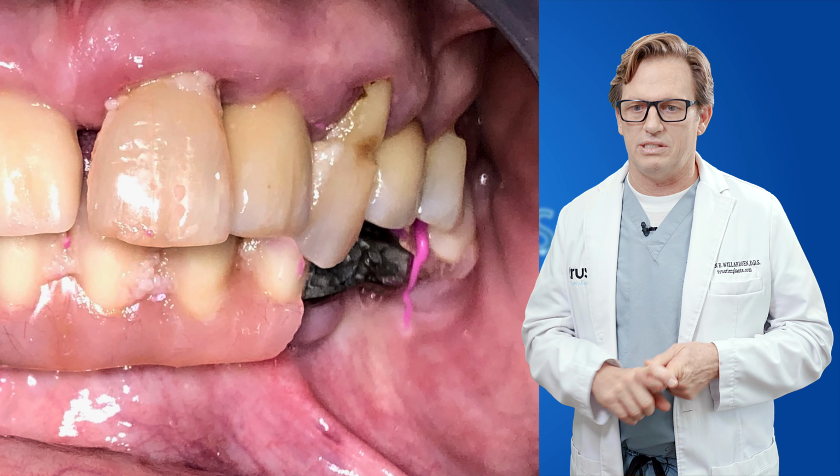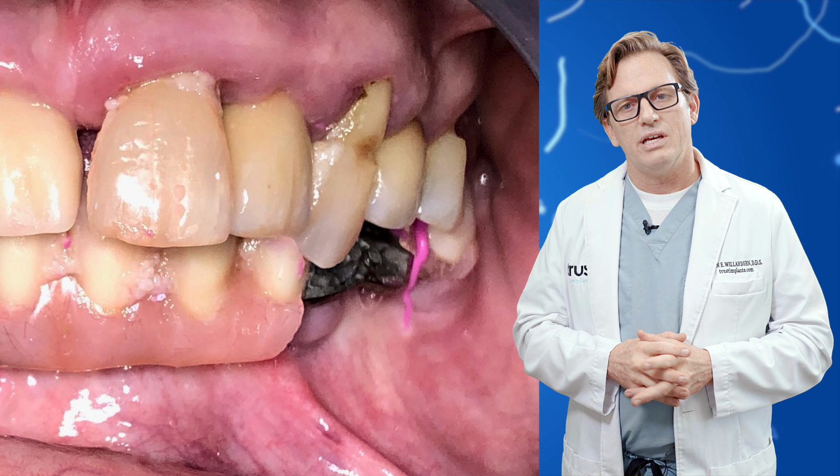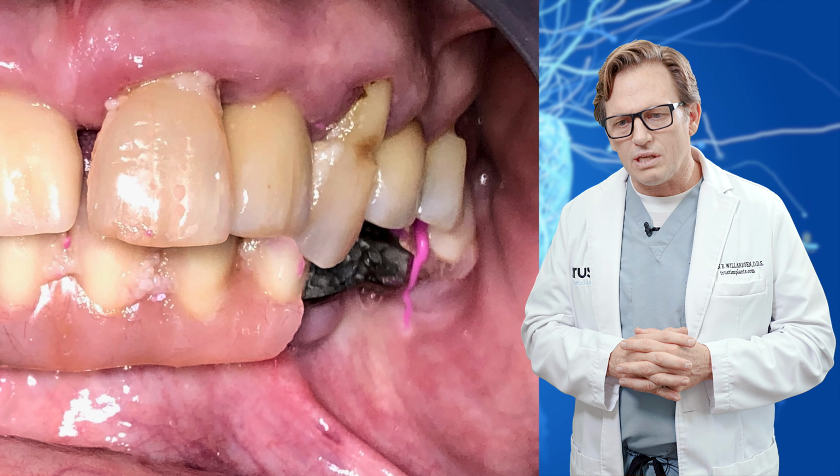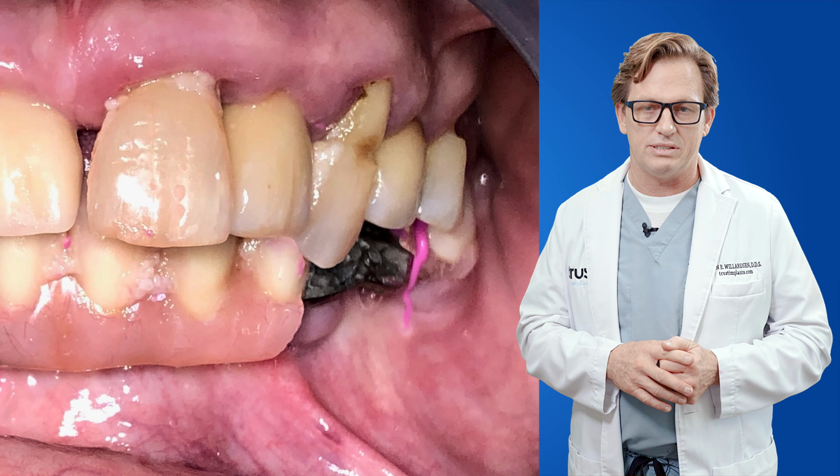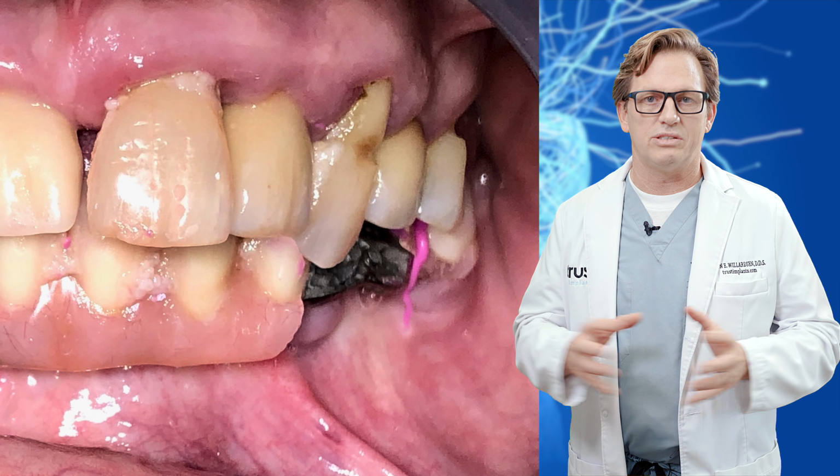She does have periodontal disease. She's got all kinds of stuff going on. And so this case has to be redone. And that's exactly what we did. We went ahead and we took out the prosthesis. We had to remove 2 implants and place new implants and reconstruct her entire mouth. But take a look at the after photo. And you can see her mouth is now relaxed, her face is relaxed, her lips are relaxed. When she smiles, it looks natural. But more importantly, the way it functions. And even more important than that is the fact that it's secure long-term, because the position of her implants now are such that biomechanically this will work out perfectly.